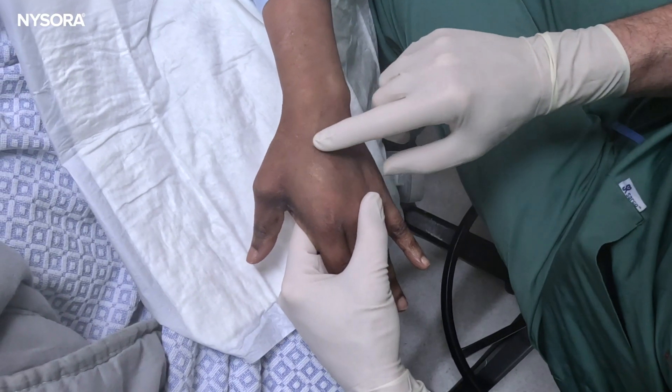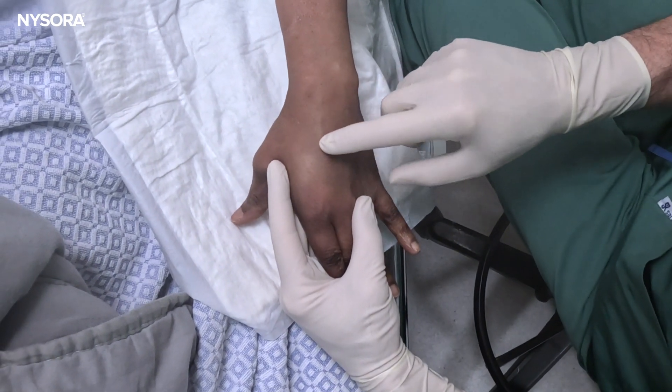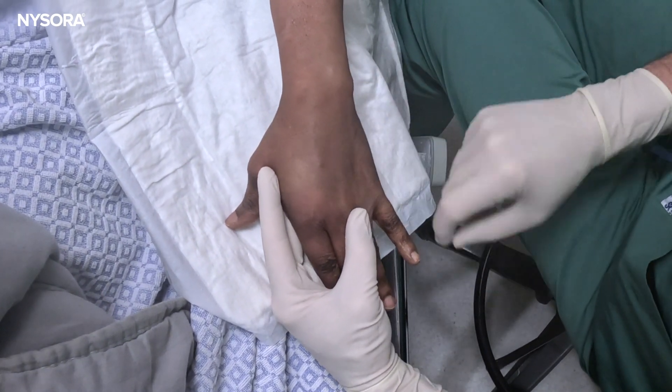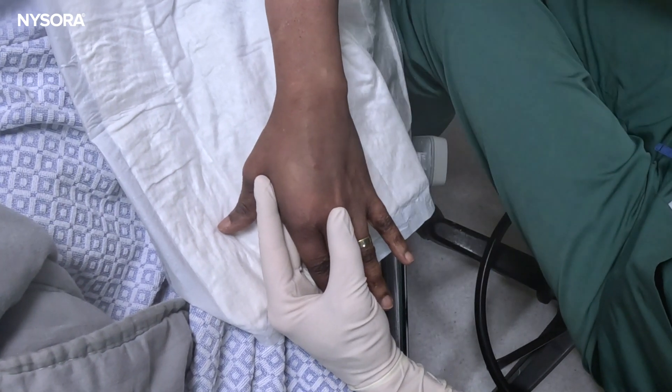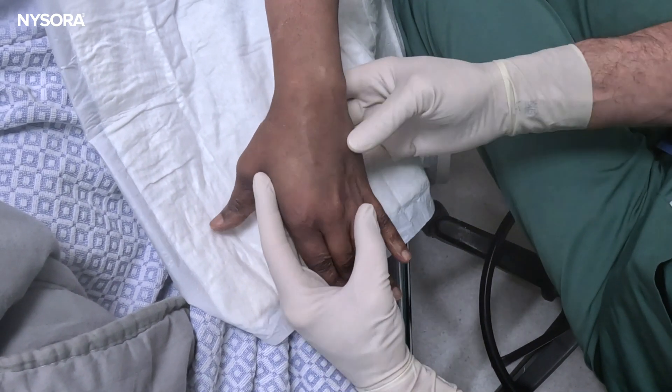There's one vein over here — I think that is a viable option. None was visible actually before application of the reverse Esmarch.